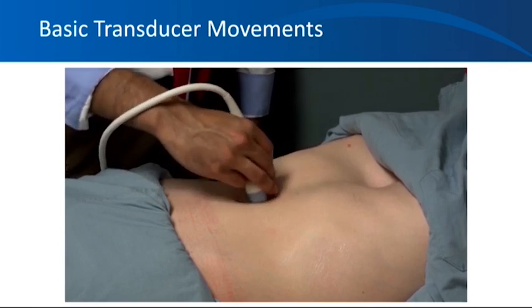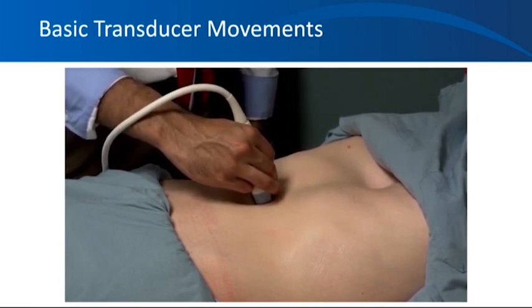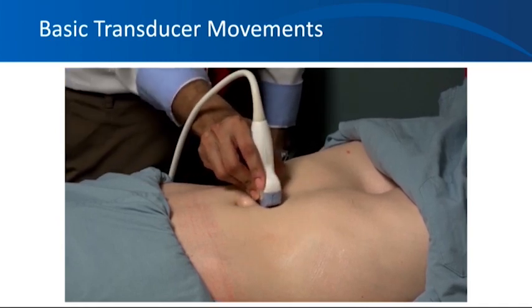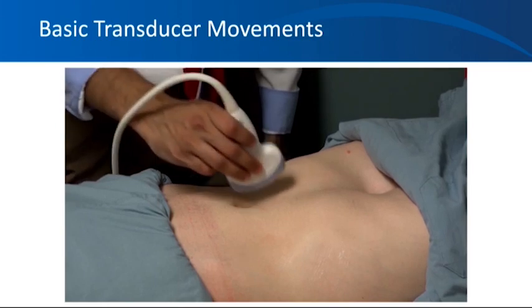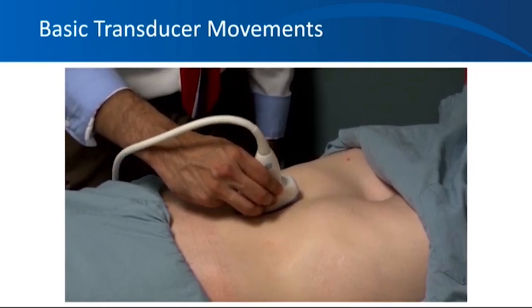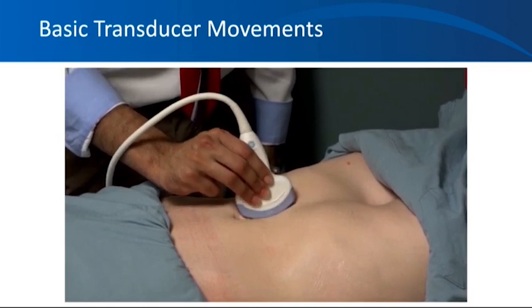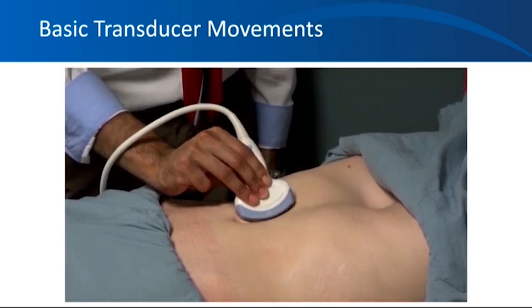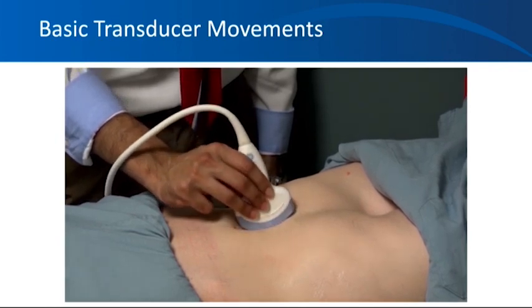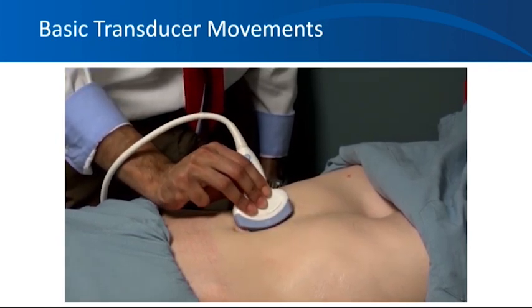The next movement is called rotation, and you can rotate the probe in the counterclockwise or clockwise direction. And this movement is called tilting, sweeping, or fanning, and it's done along the transducer's short axis. Sometimes when I say look to the right or look to the left, this is the movement I'm referring to.